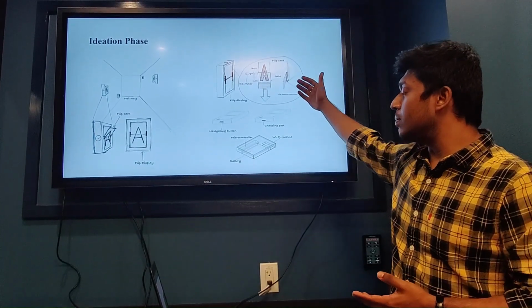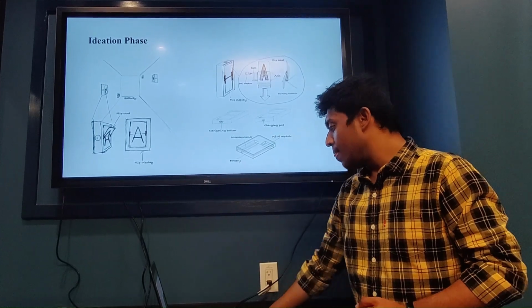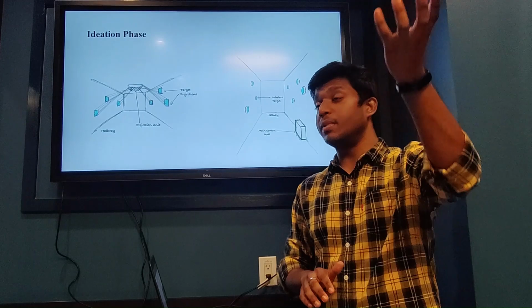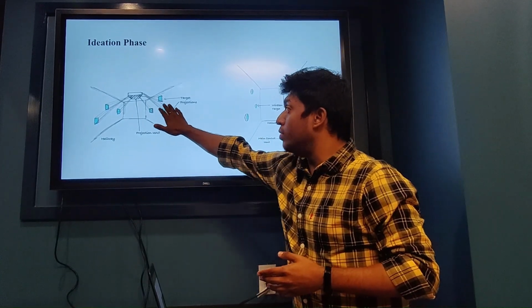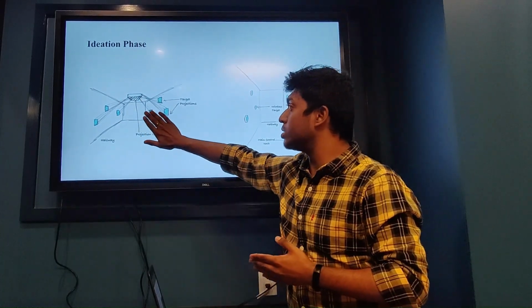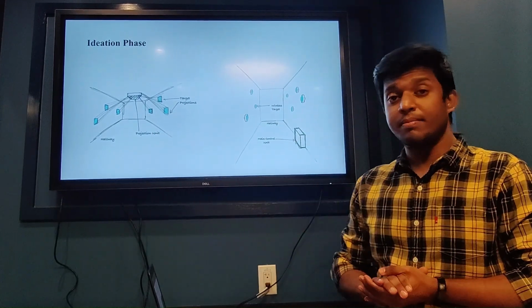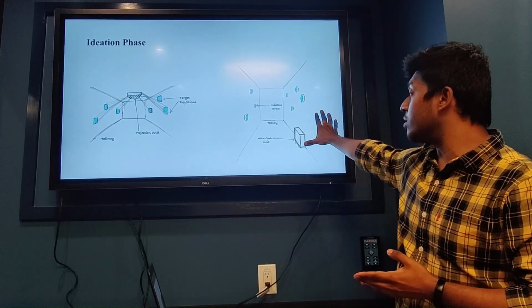However, we realized that the mechanism behind it would be too complex, and so we abandoned it, and then we moved on to other ideas. The most high-tech idea that we came up with was attaching a projector to the middle of the room, and then that would project all of these targets on the walls, and then based on us interrupting the light going to a particular target, we would get some sort of feedback. However, as I mentioned before, it was too high-tech to explore, and so this is another idea that we came up with.